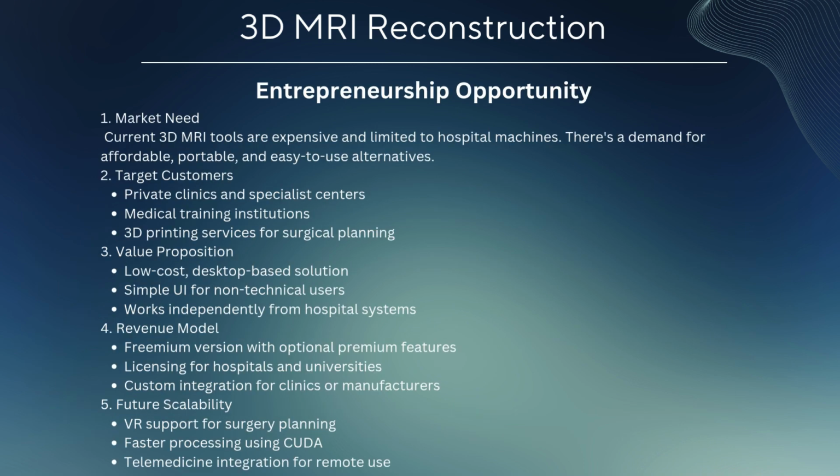Now let's look at the entrepreneurship potential of the 3D MRI reconstruction application. First, the market need is very clear. Currently, most 3D MRI visualization tools are only available on high-end MRI machines using proprietary software. This makes them expensive and inaccessible to smaller clinics or educational institutions. Our solution addresses this gap by offering a low-cost and portable alternative.